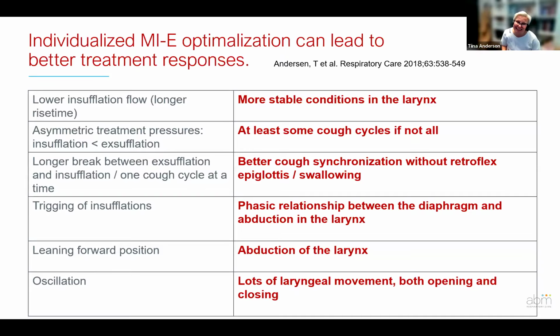Just think about athletes. Have you been following the runners from the Tokyo World Championships? They come to the goal and then they lean forward and try to get more air because they need more oxygen after their performance. So this position creates better conditions to breathe in, to abduct the larynx.